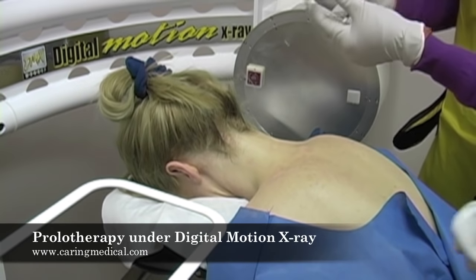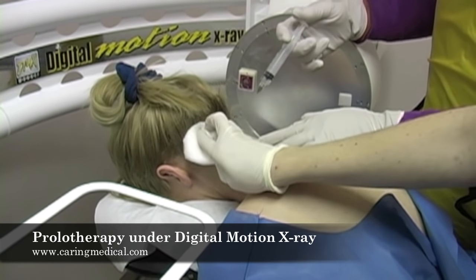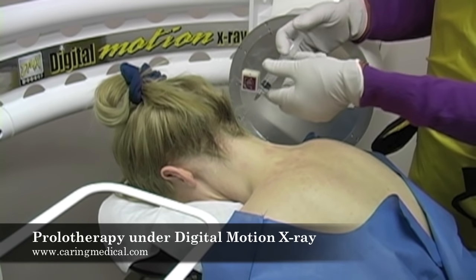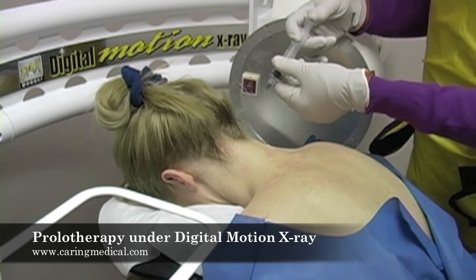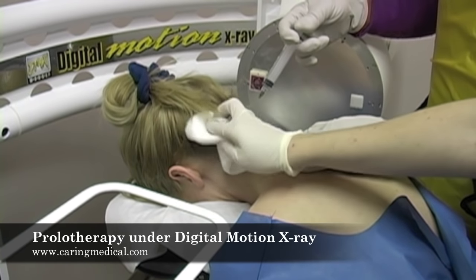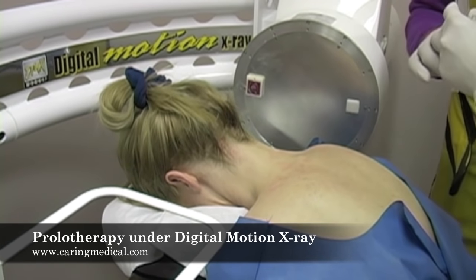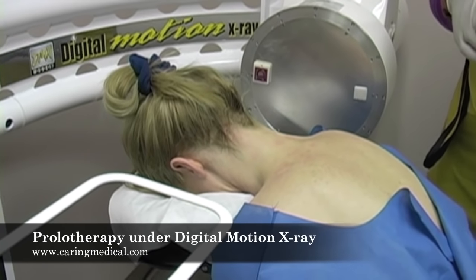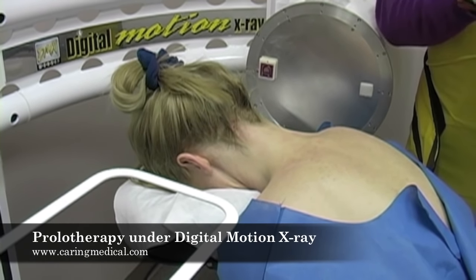Here I'm using the digital motion x-ray as a fluoroscopic unit to do injections on this particular patient who has upper cervical instability. I'm talking about C1 and C2 instability.